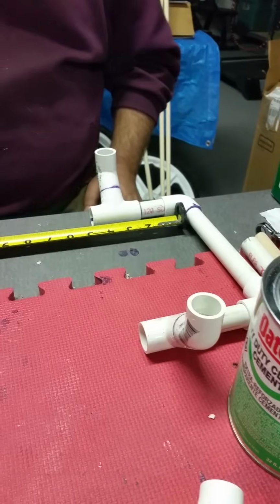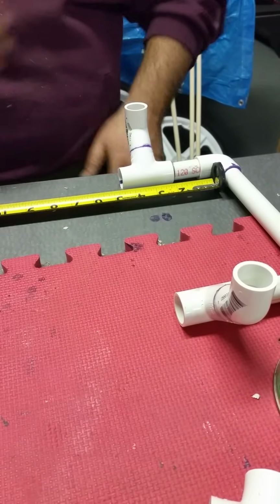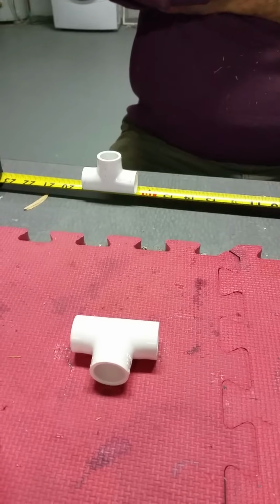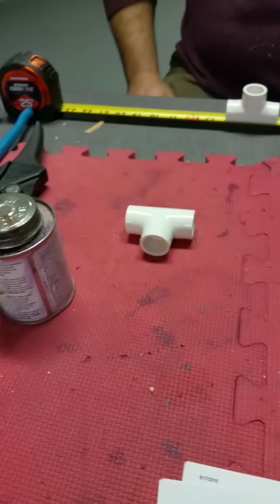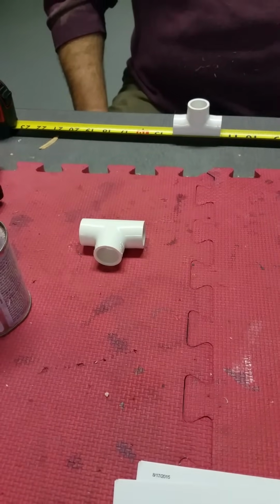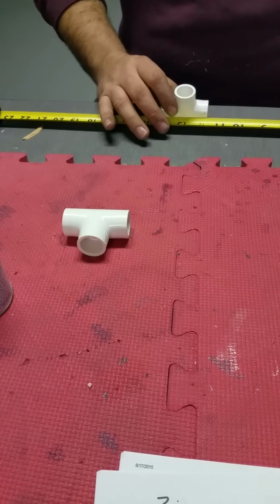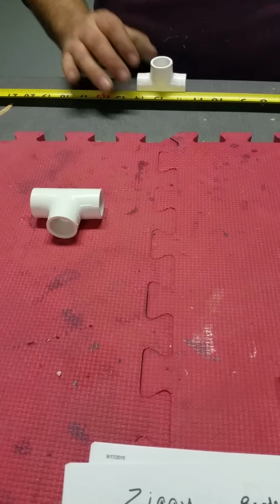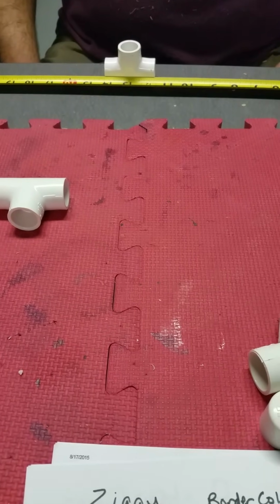And when we measure, we're measuring the inside measurements of the cart, not the outside. We don't want to measure the PVC. This particular cart is 23.5 inches long. So what we did was we divided that in half, and that comes out to be 12 and a little bit. So we're going to put that T for the belly bar at 13 inches.